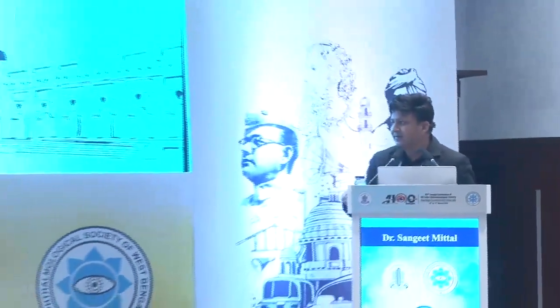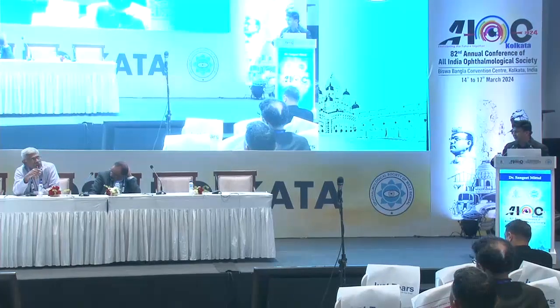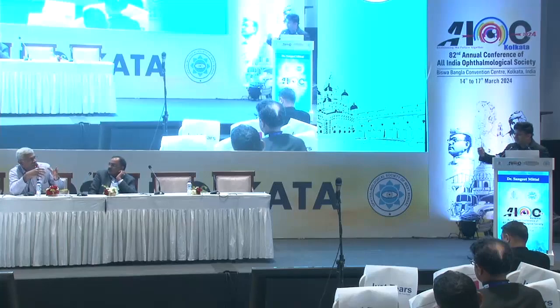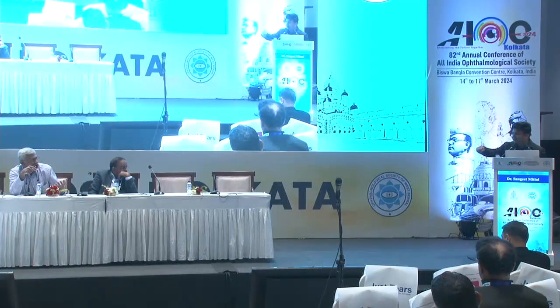The last one, why is there an air vent needle? Pardon, sir? In the last bottle, why do you have an air vent needle? Because we need an outlet. Then only the fluid goes inside the bottle. No, it's connected here, but where is the suction generated from in the bottle? Are you doing something like what you have in the GA suction machine? So the bottle is again connected to the vitrectomy machine, when you remove the bag and you connect the bottle.